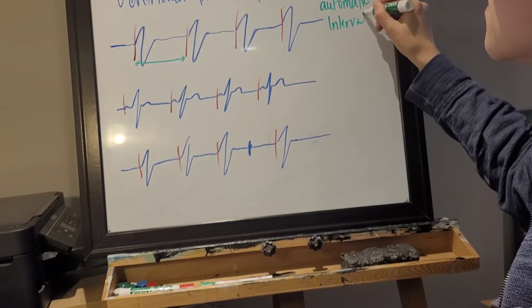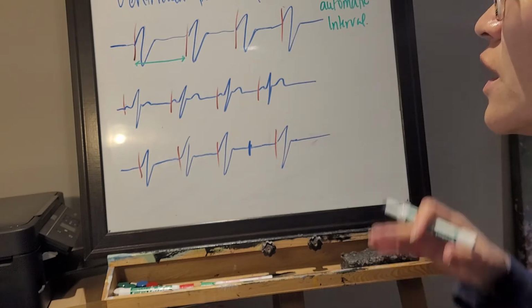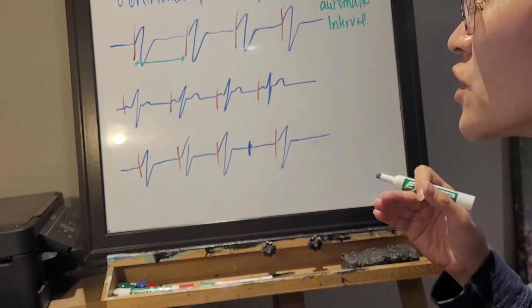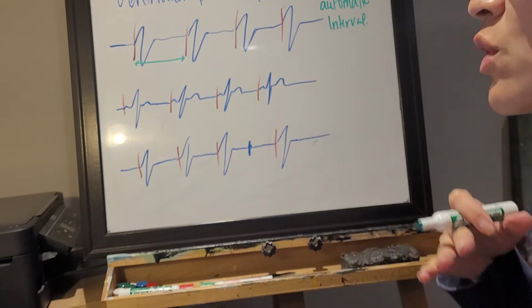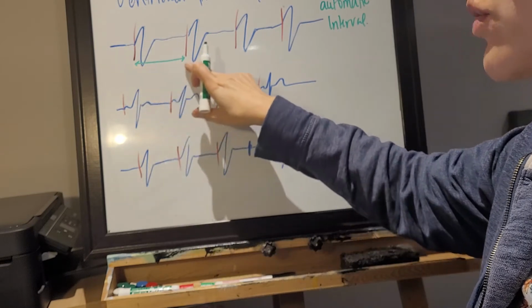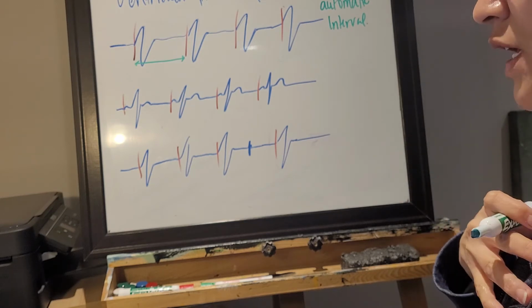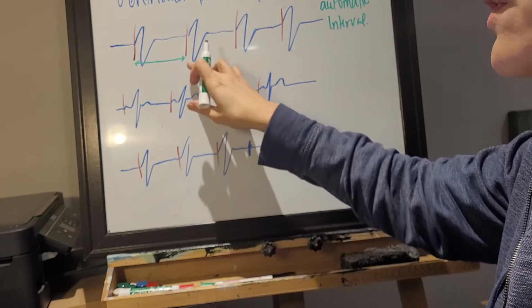interval. And this is a pre-programmed timing interval that tells the pacemaker exactly, and this is when we're talking about synchronous therapy, so we're asking the pacemaker to watch and sense, look for any intrinsic activity, and if you don't see any, then you'll fire. And so this is the time at which the pacemaker will be searching for the patient's own intrinsic activity. And then if it doesn't sense any activity, it will fire again.